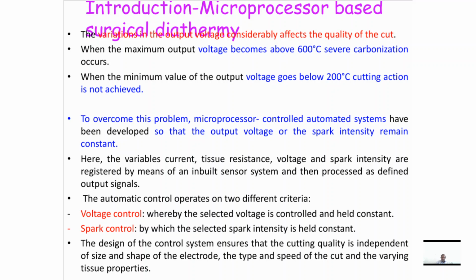In spark control, the selected spark intensity is held constant. So these are the two different criteria in the automatic control of microprocessor based surgical diathermy.